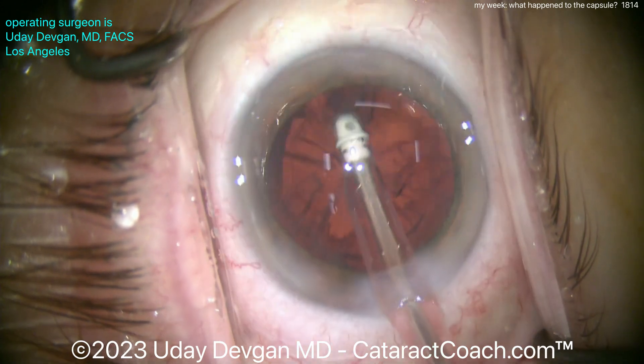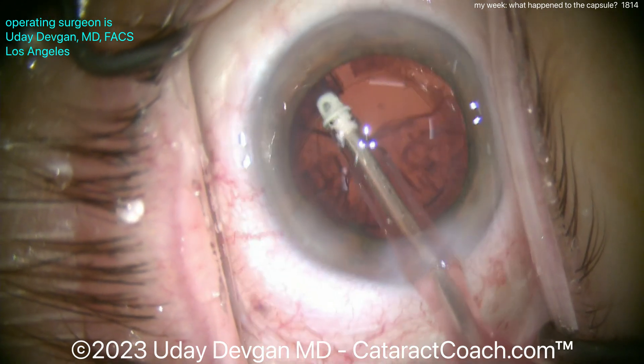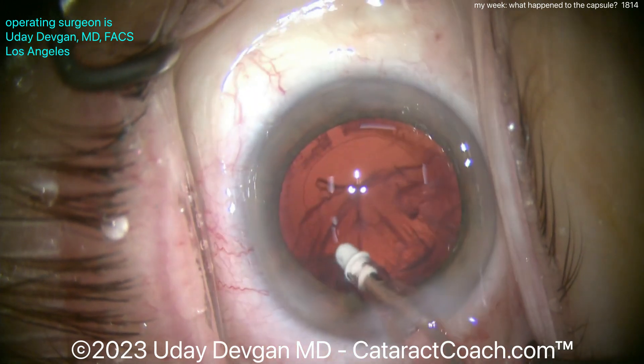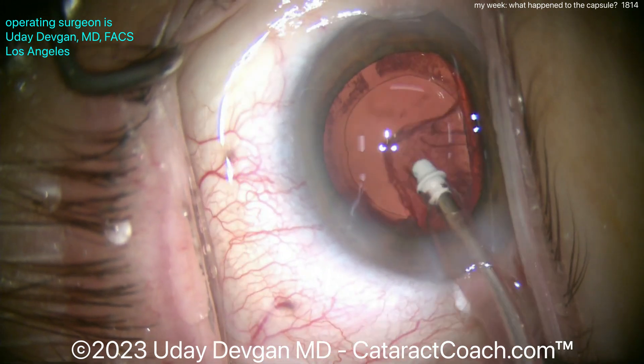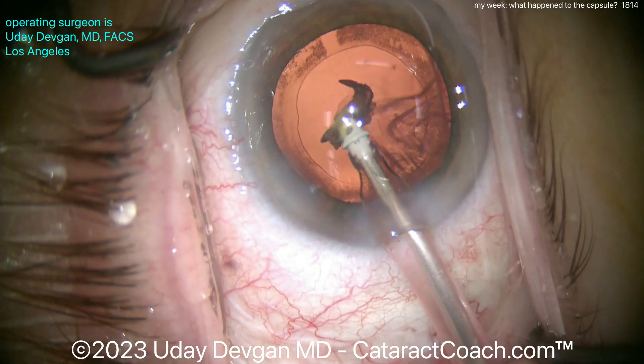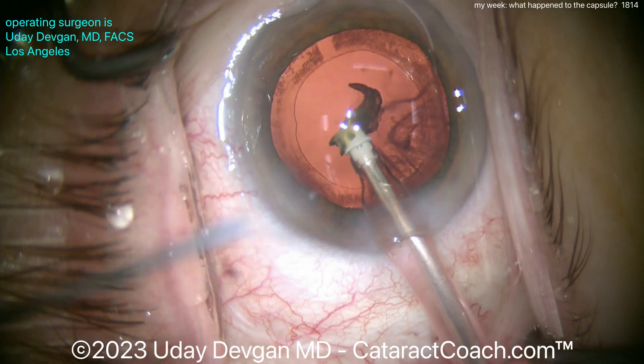Taking another piece of cortex and that looks pretty routine, coming up nicely. I'm looking at the rhexis edge — that seems pretty good. It's not moving around; I don't think there's any zonular weakness so far. Oh, a little bit of nuclear chip, so we can try to aspirate that with the I/A probe, maybe use a spatula to push it into the port.